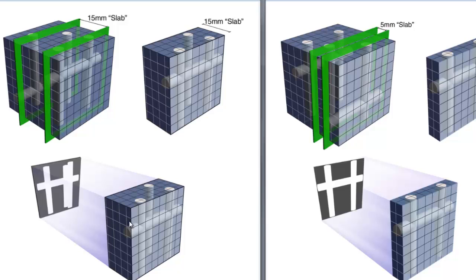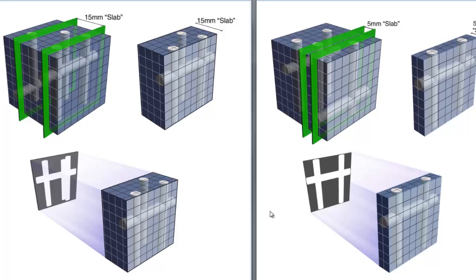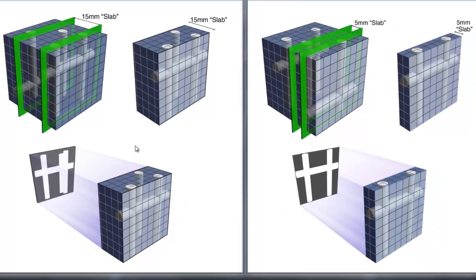At some point there will be an optimum thickness. So you can choose to make it in this case 15 millimeters, you can make it 5 millimeters. In this case because the arteries are running straight up and down this achieves the optimum projection where we can see individual arteries silhouetted against brain or subarachnoid space.